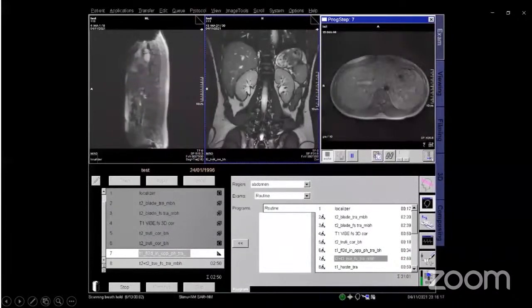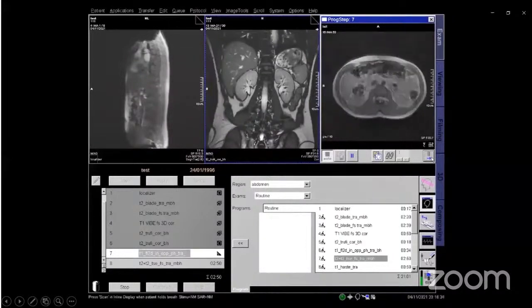And it's a breath hold sequence. So here you ask the patient to hold the breath, and after that I can press here. So the sampling will be done. When the sampling is over, then I'll ask the patient to release the breath and be calm. And after 5 to 10 seconds, again I'll ask the patient to hold the breath and continue the sampling here. So here I forward a little bit.